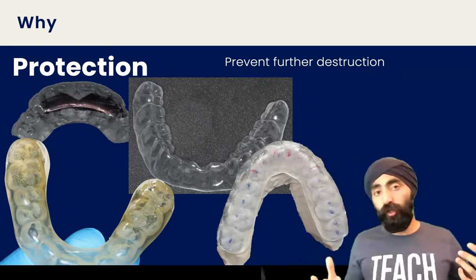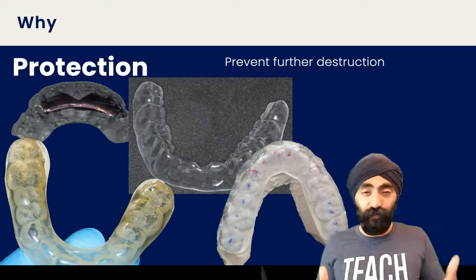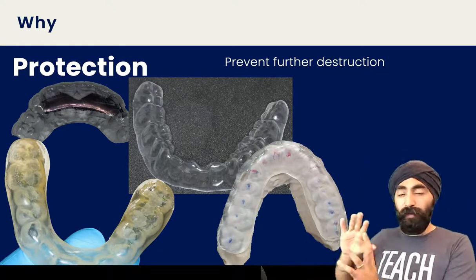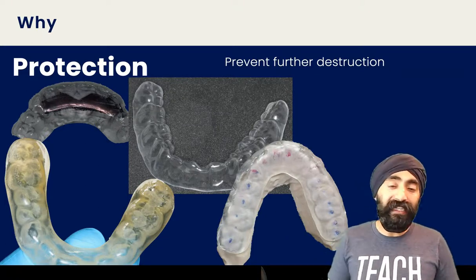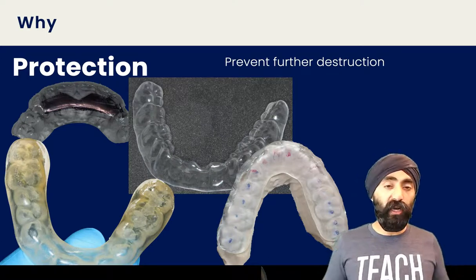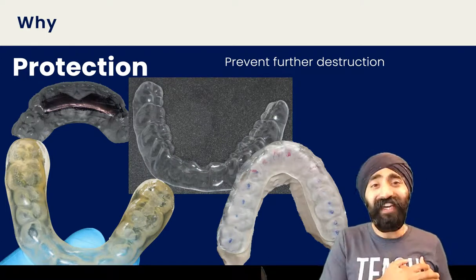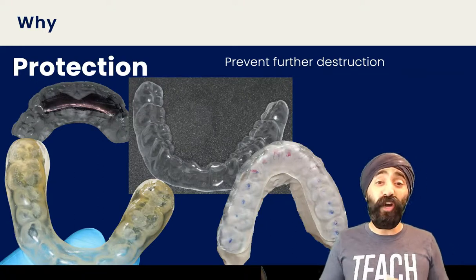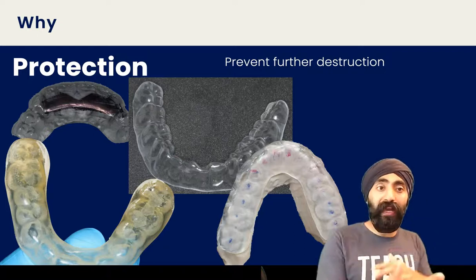We also aren't doing complex OVD increasing dentistry every day unless you're a specialist. So diagnosis may be something else. Protection is something that a lot of patients might need or you might suggest because patients come in and you've diagnosed bruxism and you're worried that they're going to destroy your delicate veneers or break your crowns or start breaking their own teeth. So I think protection is a good thing to cover in this lecture, right?